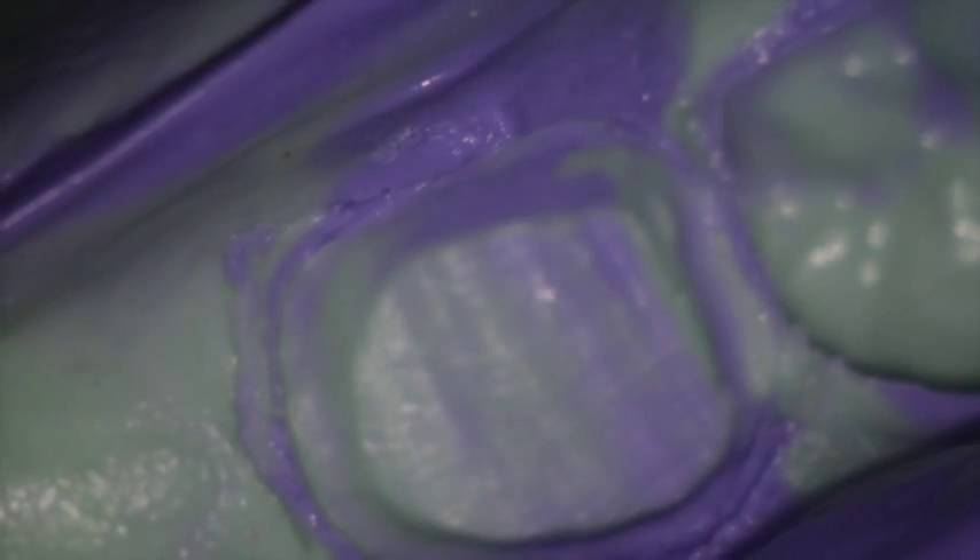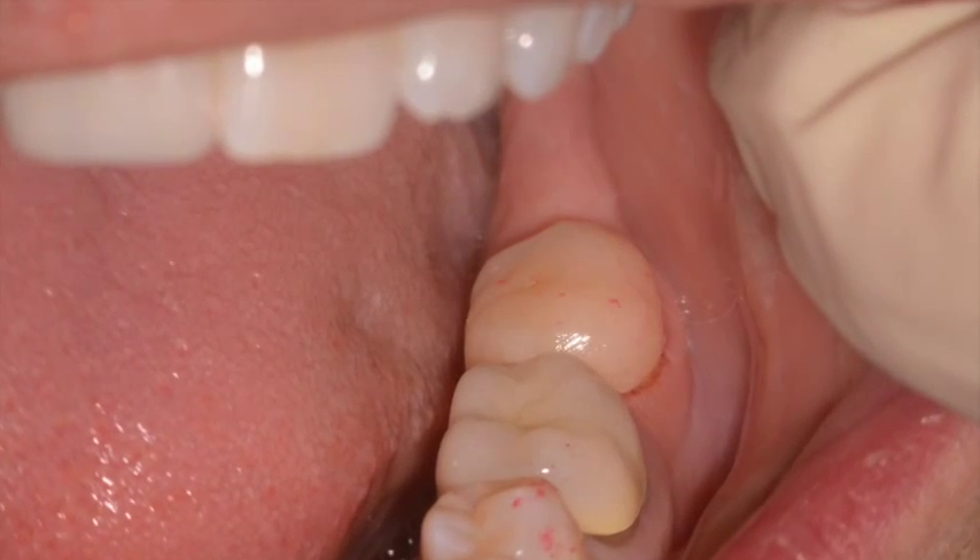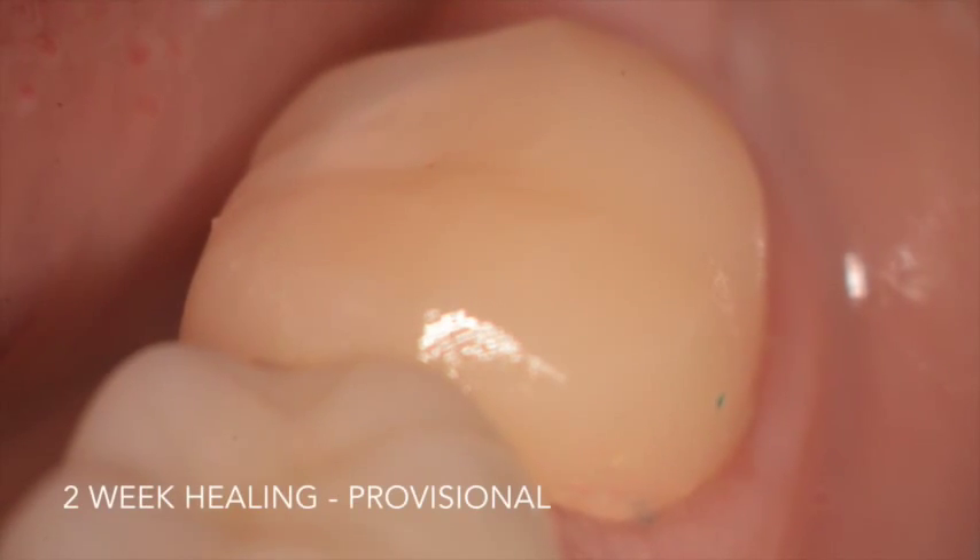Here is the VPS impression material. The provisional is placed and the patient is dismissed, coming back in two weeks.